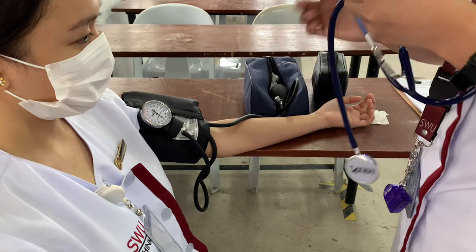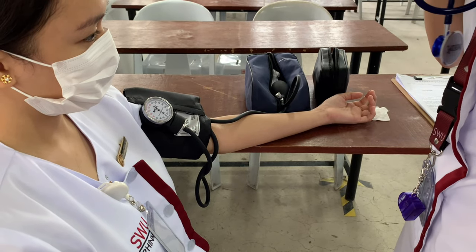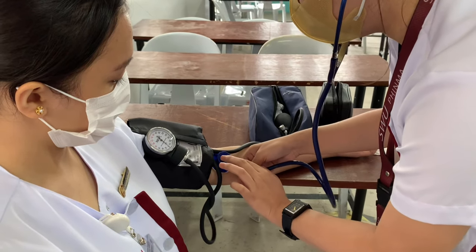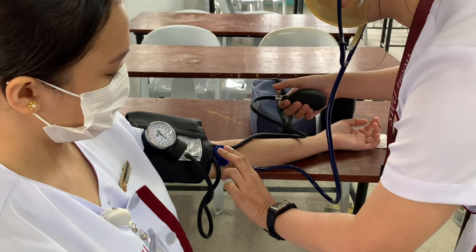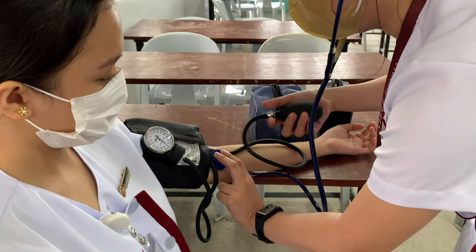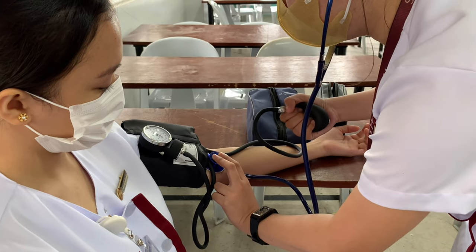Place the stethoscope earpieces in the ears properly. Then position the diaphragm of the stethoscope firmly but with as little pressure as possible over the artery where the pulse is felt. Do not allow the stethoscope to touch clothing or the cuff. Sound is heard best directly over the artery. Placing the head of the stethoscope under the edge of the cuff results in considerable extraneous noise and may cause inaccurate readings.